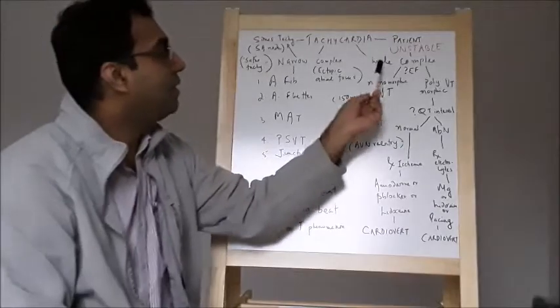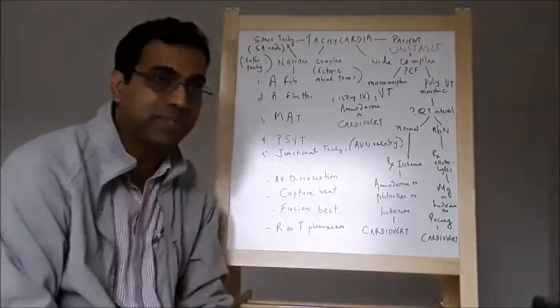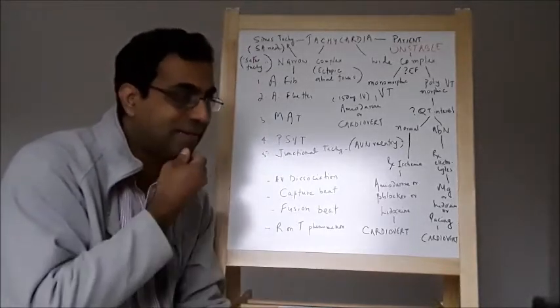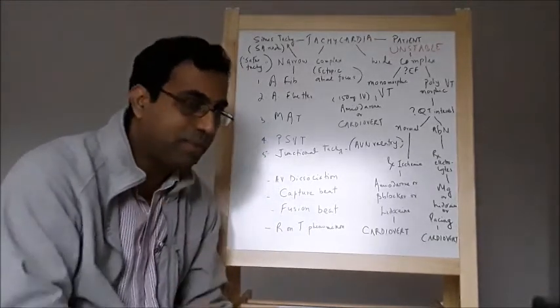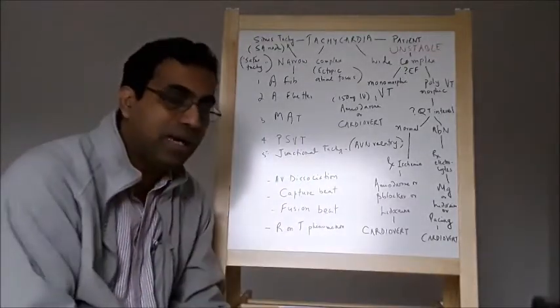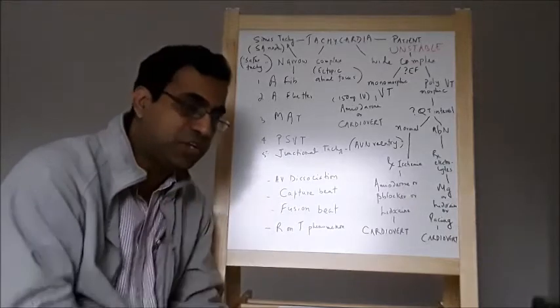Coming to our wide complex tachycardias, the nurse has come to you. She's in a state of profound panic, and she's saying that the patient has a weird rhythm on the monitor, and do something about it. All right. So then, when you approach the patient and you look at the rhythm strip, I'm saying that you already have access to a monitor and you're not getting an EKG.